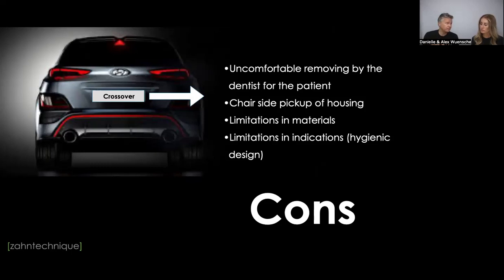That limits the restoration already, because if you go from a regular overdenture with 4 implants and locators, and now we want to transition that to a fixed, we have to make sure there is no transition line visible afterwards, because we have to remove the flange, right? That's important. These restorations, as Locator Fixed, do not provide the lip support we may have on a Locator Overdenture, right? So keep that in mind.